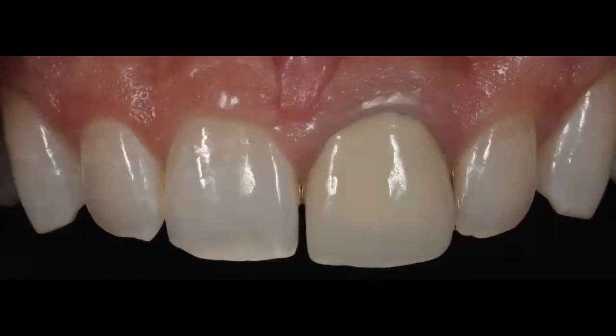Now, when we look at this photo, and this is how this case started, if we have to decide if this is imperceptible, acceptable, or not acceptable, it all depends on the patient's view. And this for the patient was unacceptable. So the patient came to us because they were unhappy with this specific restoration in their mouth.